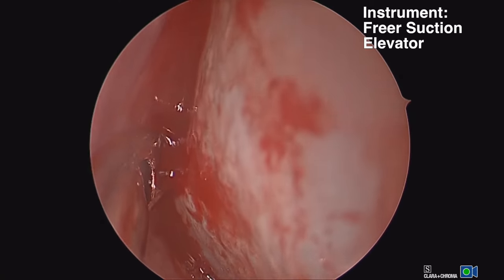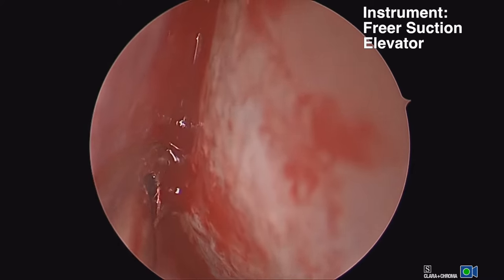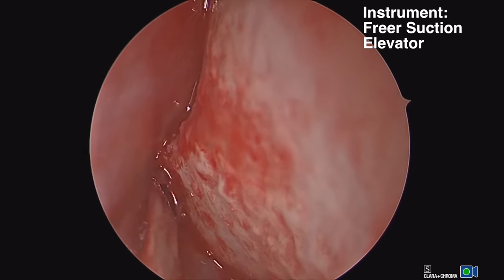Where the spur is located on a septal deviation is the most likely site of a rent or a tear in your mucosa, and if possible, you would like to avoid making a tear.